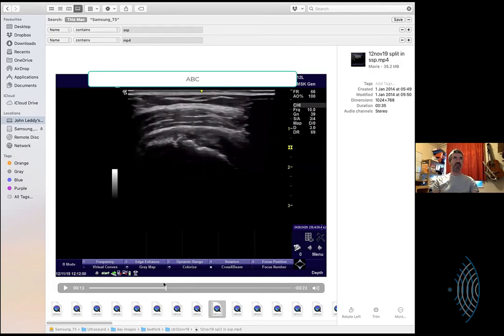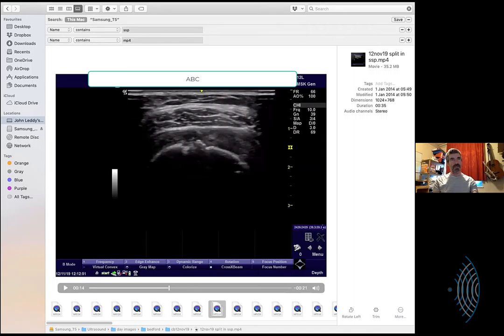Of the entire cross-sectional area, your gut says 30%? Do you even say stuff like that? I don't even say stuff like that. I would be descriptive. I can't quite work out from here which side the biceps is on even. But if the biceps was this side, I would say the leading edge, the anterior portion of the tendon, looks intact. And then there is general breakdown in the quality of the posterior half of the supraspinatus.